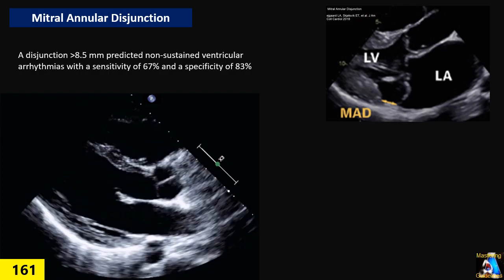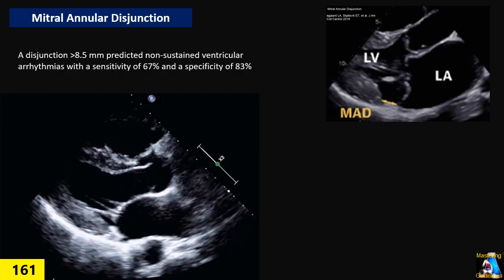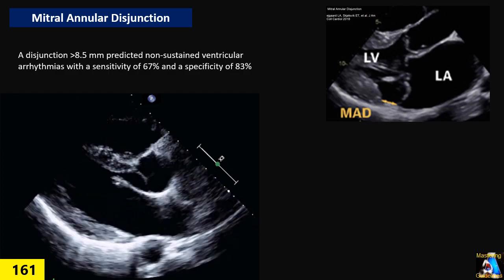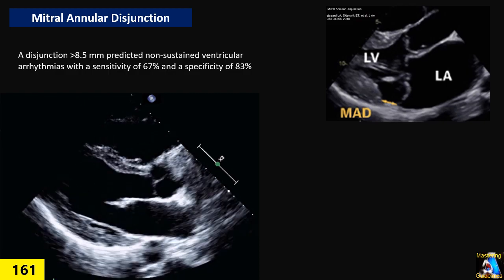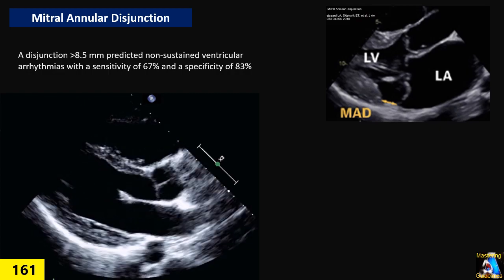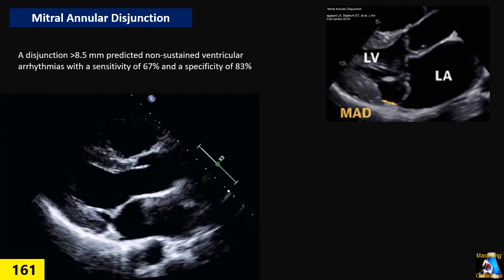As you can see here, in this case, this amount of displacement of the insertion of the mitral valve annulus is very obvious.